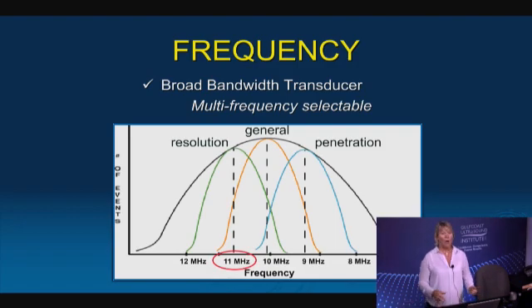the lowest structure. In contrast, if I have a little 90-year-old lady that has no body fat and I put the transducer on at gen, everything's going to be bright and white and blowing out at you, and you know that you need to increase your frequency to tone it down a little bit so that you're not making any kind of mistakes.